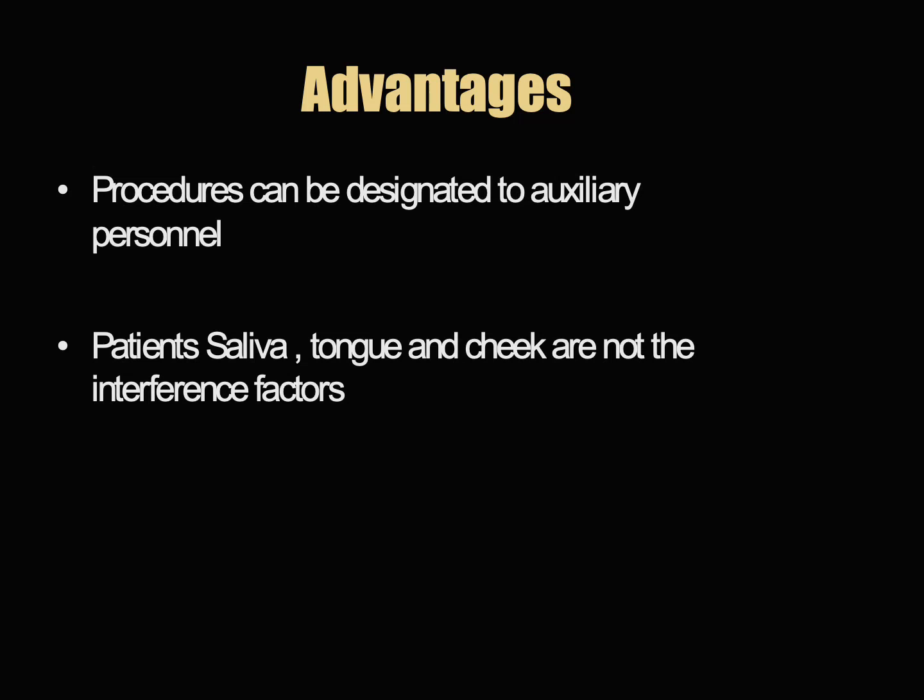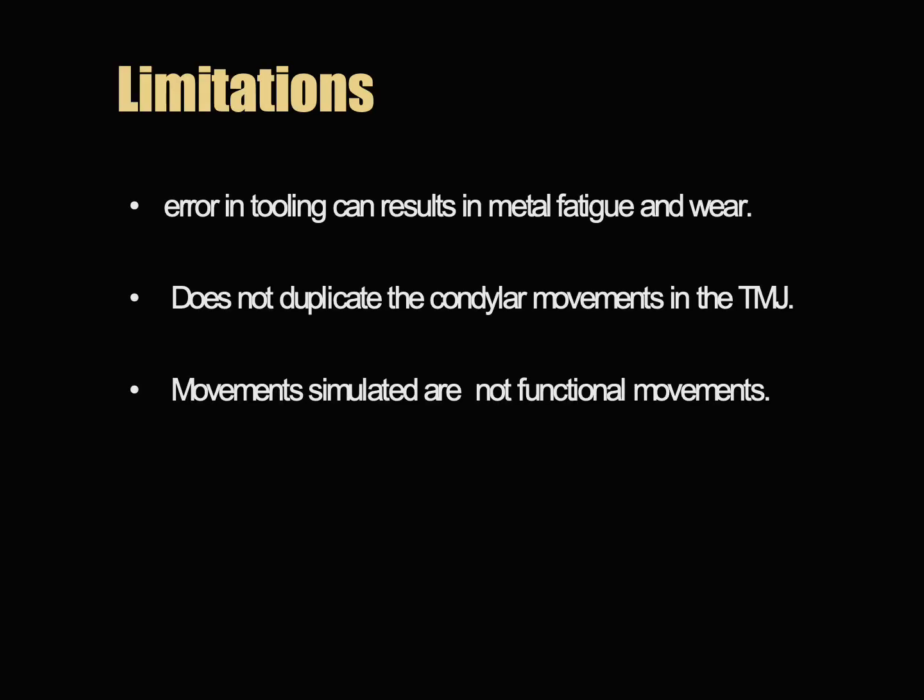Procedures can be delegated to the auxiliary person. The patient's saliva, tongue or cheek are not interference factors. However, there are limitations, like error in tooling can result in metal fatigue and wear, and it does not duplicate all the condylar movements or mandibular movements in the temporomandibular joint. The movements simulated may not be the functional movements.